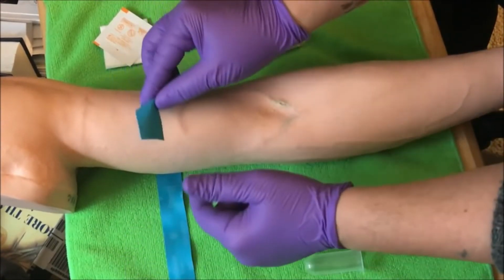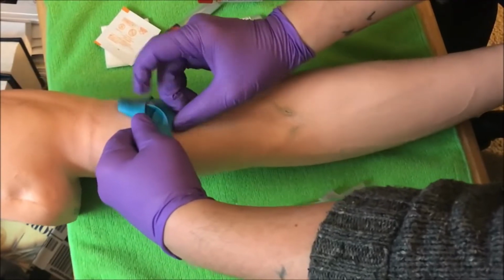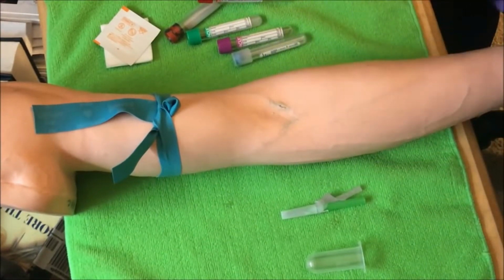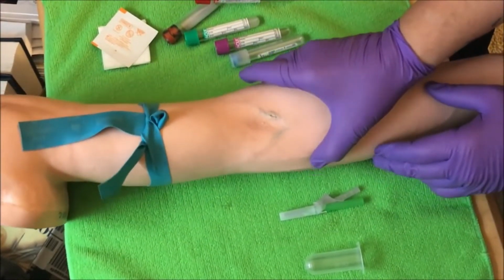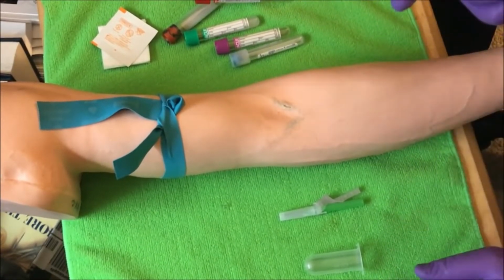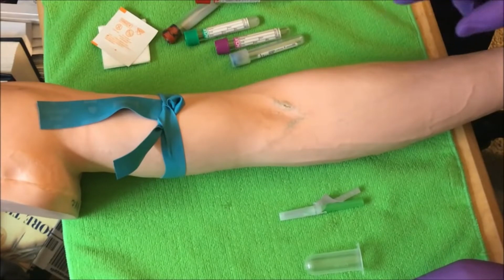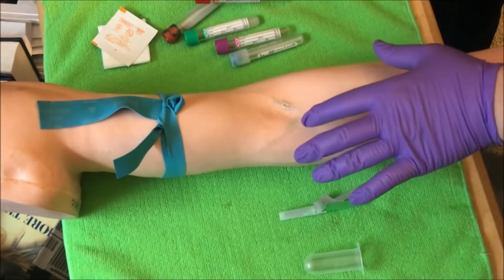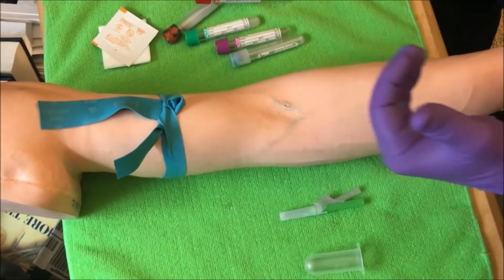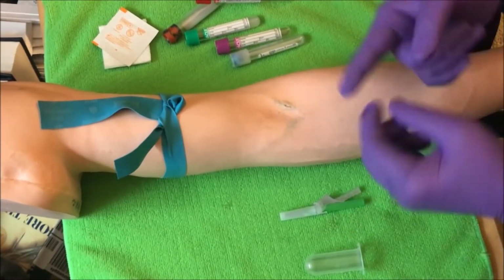Once I've ID'd the patient, and I told you before, I tie the tourniquet, I want to locate a vein and make sure which one is the best vein possible. Then of course I want to make sure that the patient is comfortable. I'm not rolling my tourniquet here, and I've got good veins. I want to take my finger here. Now this might be a challenge with the gloves, but you have to learn to feel a vein with your gloves on. I don't like palpating an arm without gloves because I don't know if the patient has anything on the skin. I don't want to catch anything or transmit anything to myself. So you're going to have to learn to master this.